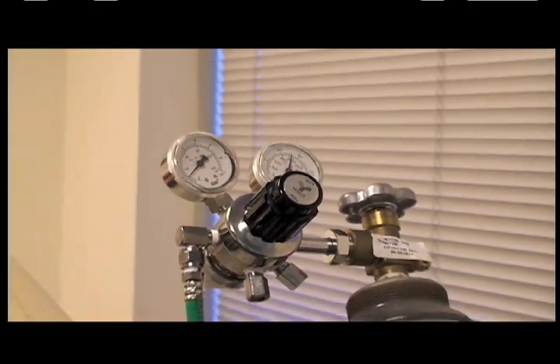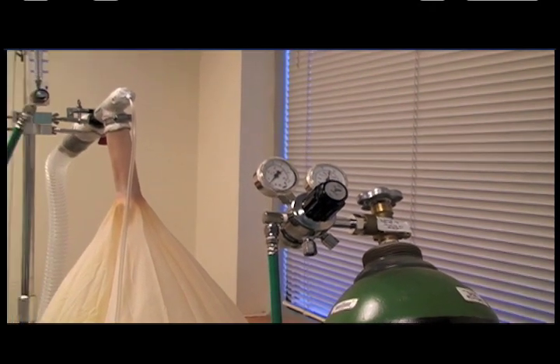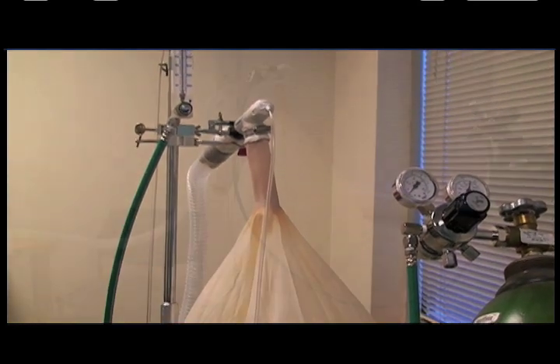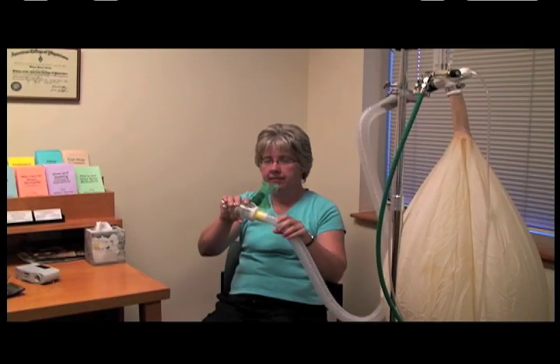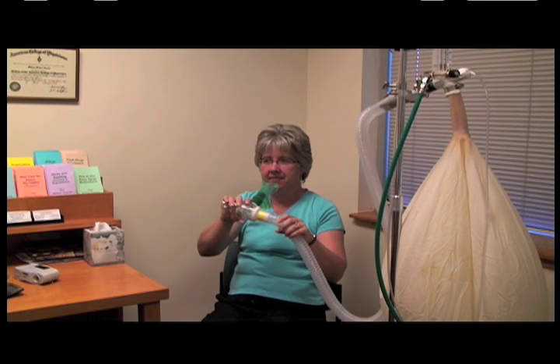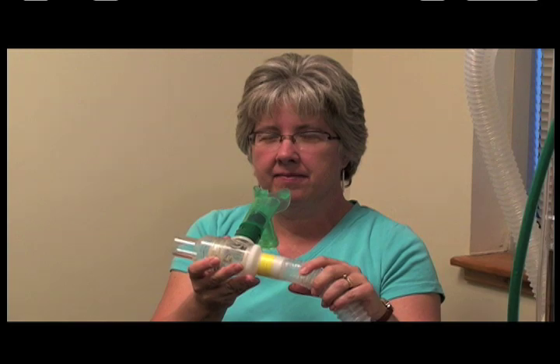Briefly, the regulator on the gas tank is connected to plastic tubing that is in turn connected to a rotometer and then to a balloon reservoir. Tubing from the balloon reservoir is connected to a low resistance, low dead space breathing device. The tank, tubing, and required devices can be set up rather easily.